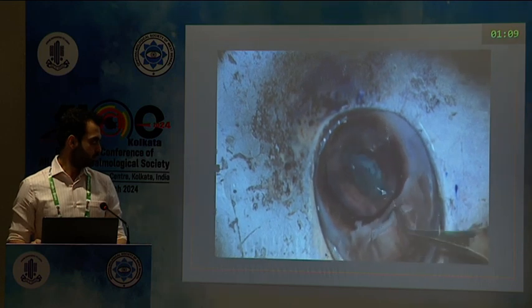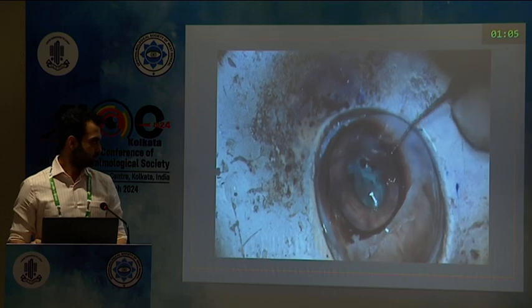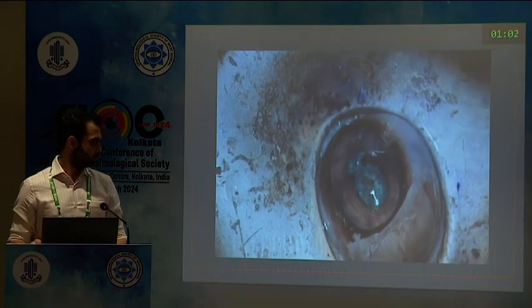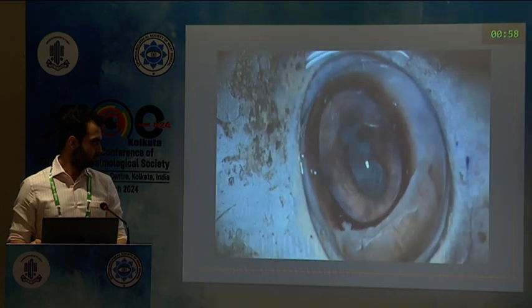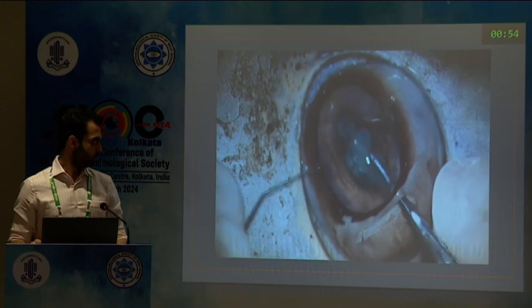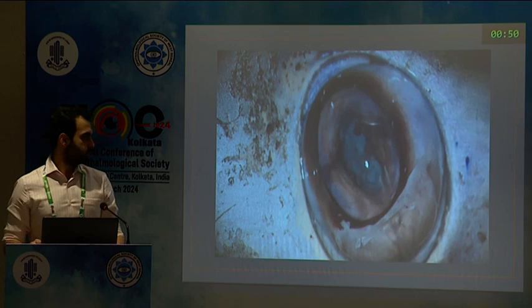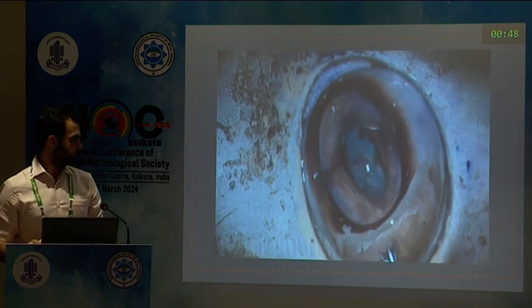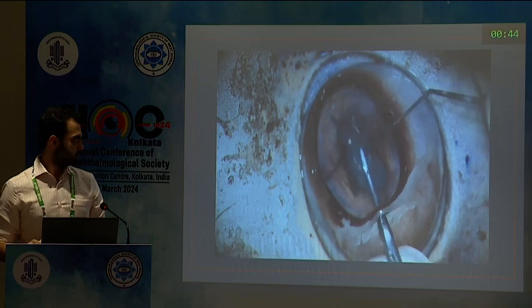And we go in and put the iris claw lens into the anterior chamber. It's not necessary to align it exactly at this point, and we can go ahead and do that with the dialer. That's much easier since the chamber has more chances of staying formed at that time. Inject some viscoelastic under the lens, and then we go in with the iris claw holding forceps and the enclavator. It's necessary that we hold the iris claw lens exactly in its center so that our enclavation site is in the correct place. Go in and enclavate it from one side, reform the anterior chamber with viscoelastic, go in again, hold it in the center and enclavate it from the other side.